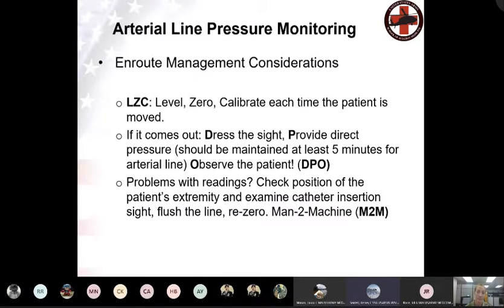Honestly, whenever I flew with my ECCN, we kind of pre-designated roles. Whenever we noticed whoever was on that side, we would either remind each other to do it, or it was just kind of a part of our processes. If we knew our flight routes, we were pretty good about having the pilots tell us when we're at certain altitudes, if we came down or up, or if there was any movement for any reason, just so we could monitor the lines and re-zero if we needed to.